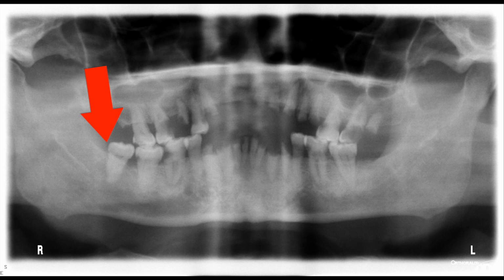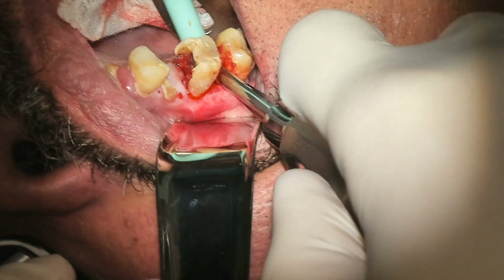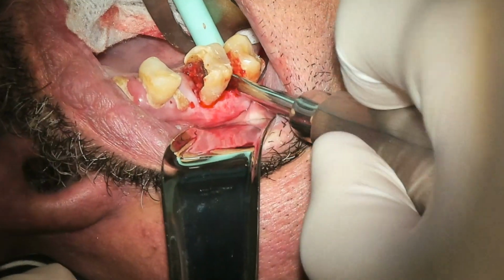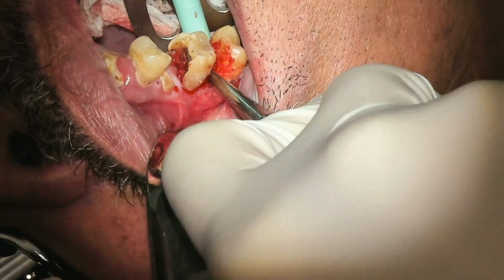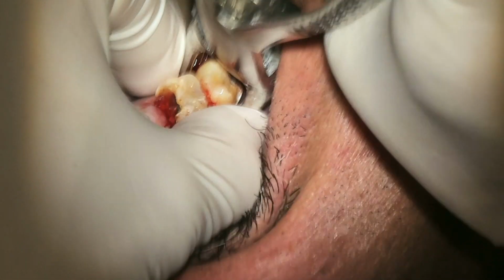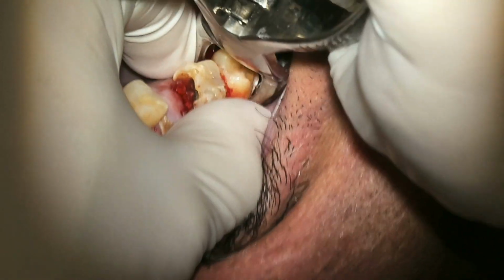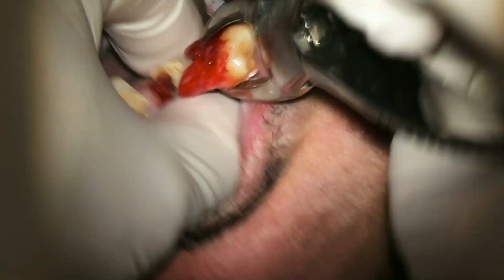So how are we going to go ahead and plan this? Now, here's a before and after photo. The immediate denture steps have already taken place. So I go ahead and remove 2 first here to gain access to 1. After this is removed, I move distally with an incision with the scalpel to remove the root tip left in 1.